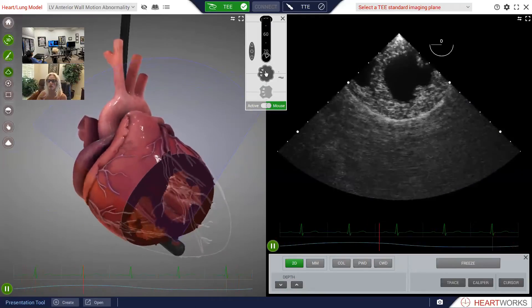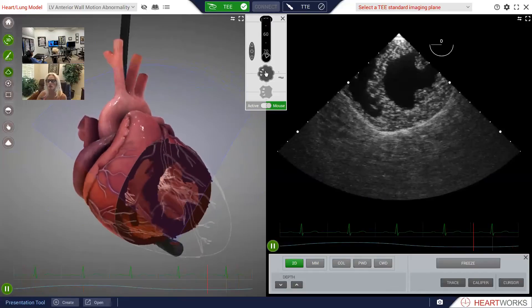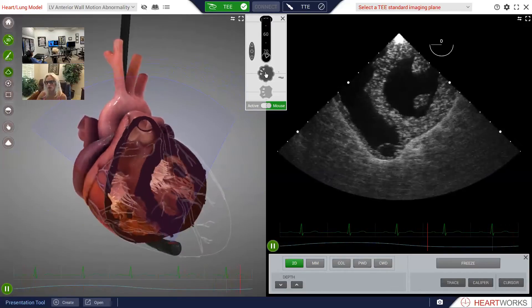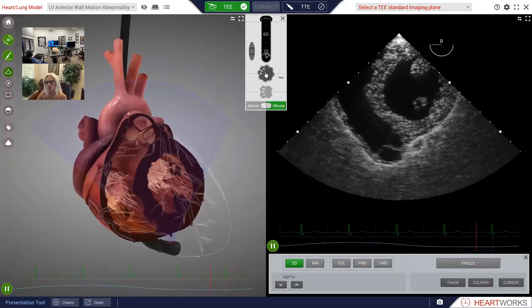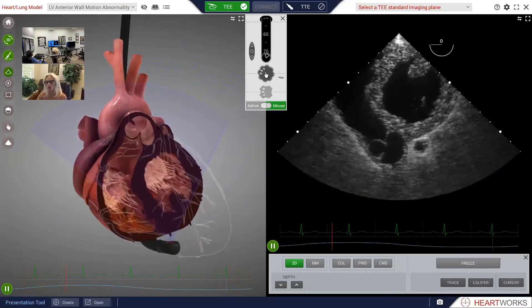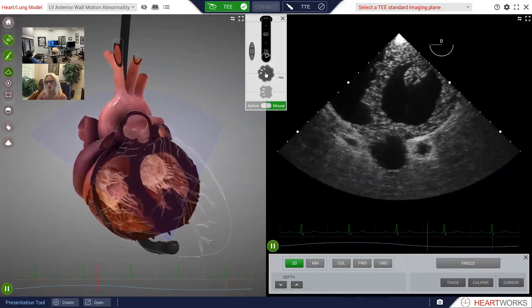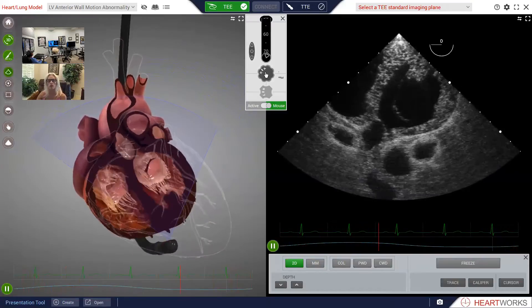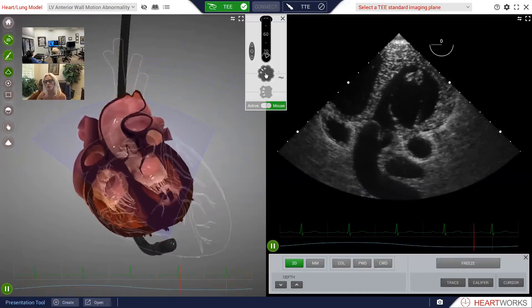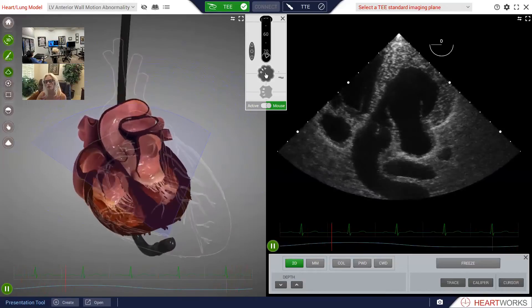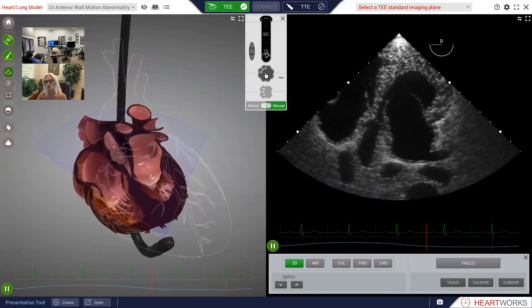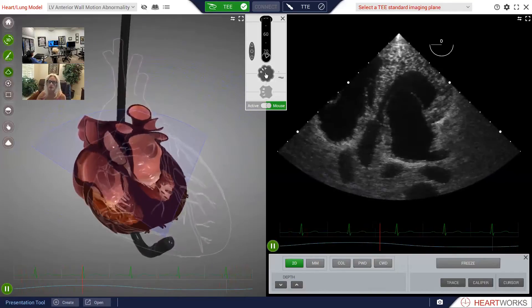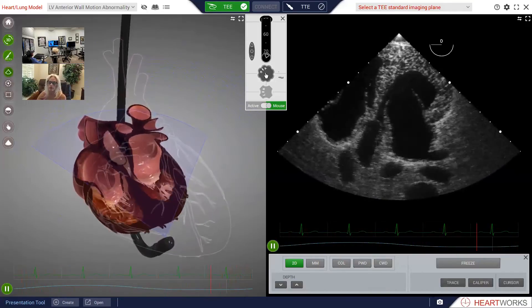To do that, we'll use a fairly hard anteflexion. Go ahead and start anteflexing the probe. Here comes some more anteflexion. I'm going to get you to actually over-anteflex it a little bit so that we see the tricuspid valve in long axis, just to demonstrate where we are. Why don't we stop there? Here's the tricuspid valve in long axis on the left side of the sector.